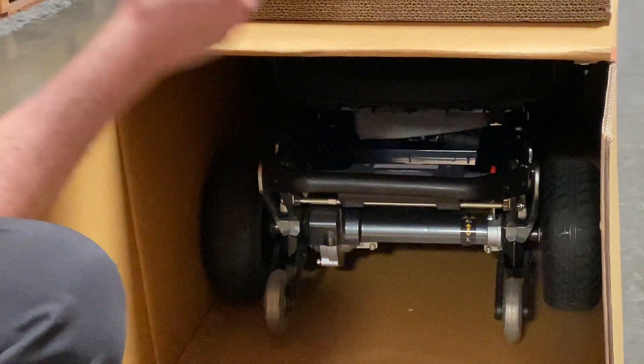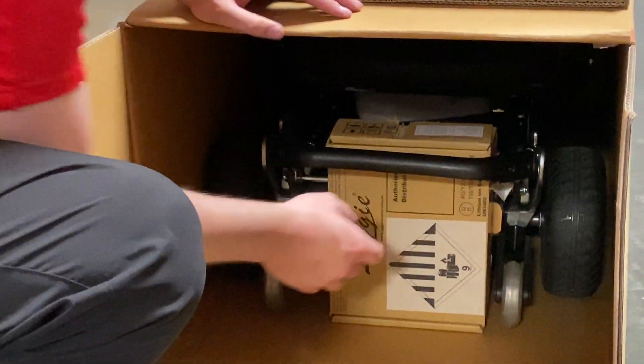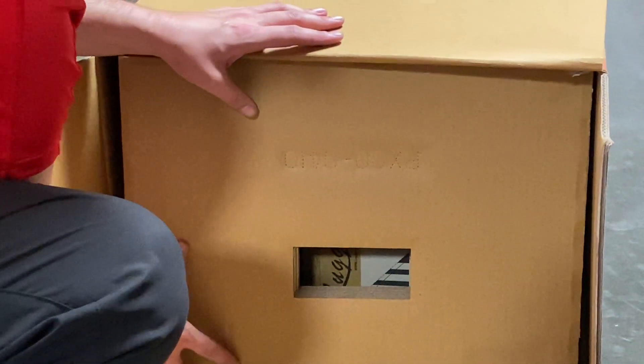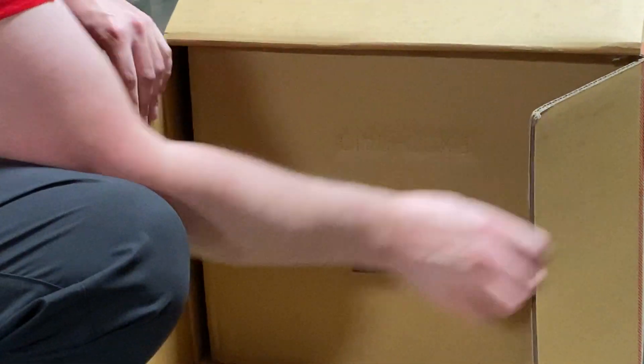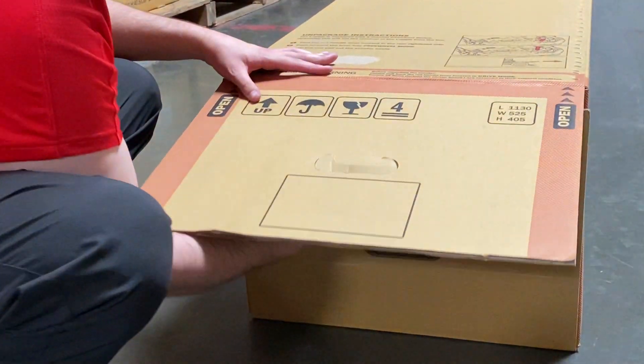Bring your battery and slide it right in behind the right bumper. Put your packing material back with the opening on the lower side. Close up your box and you are ready to send it back to us.